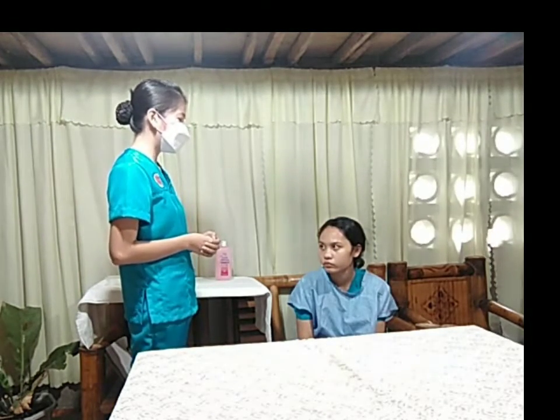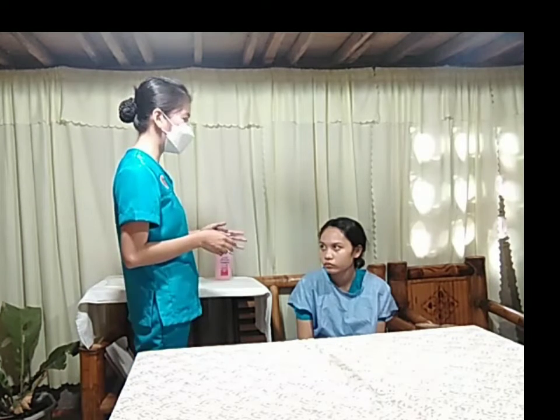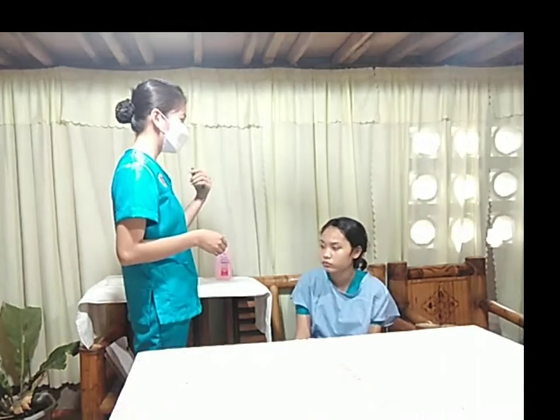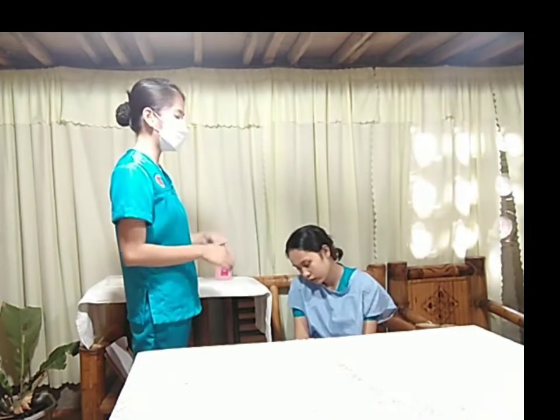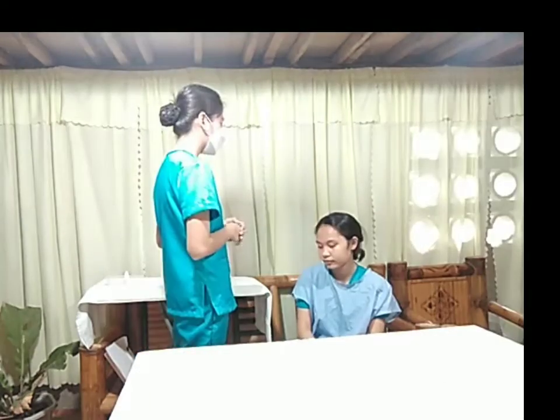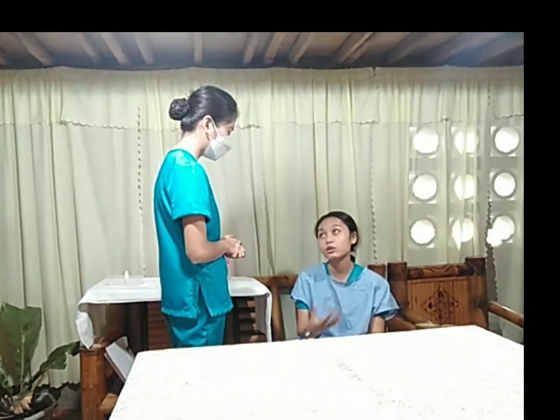If this may be the case, then we instruct the client to breathe through one nostril, then the other side, one at a time. So ma'am, how is your breathing now? Okay na, nurse. Comparing before and after our medication administration, ma'am, is it better? Yes, nurse.